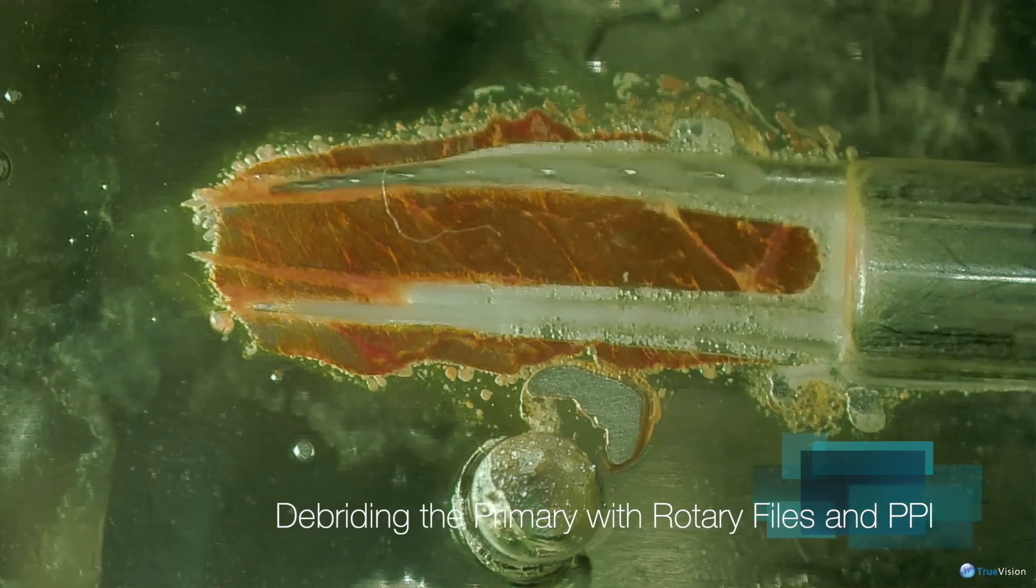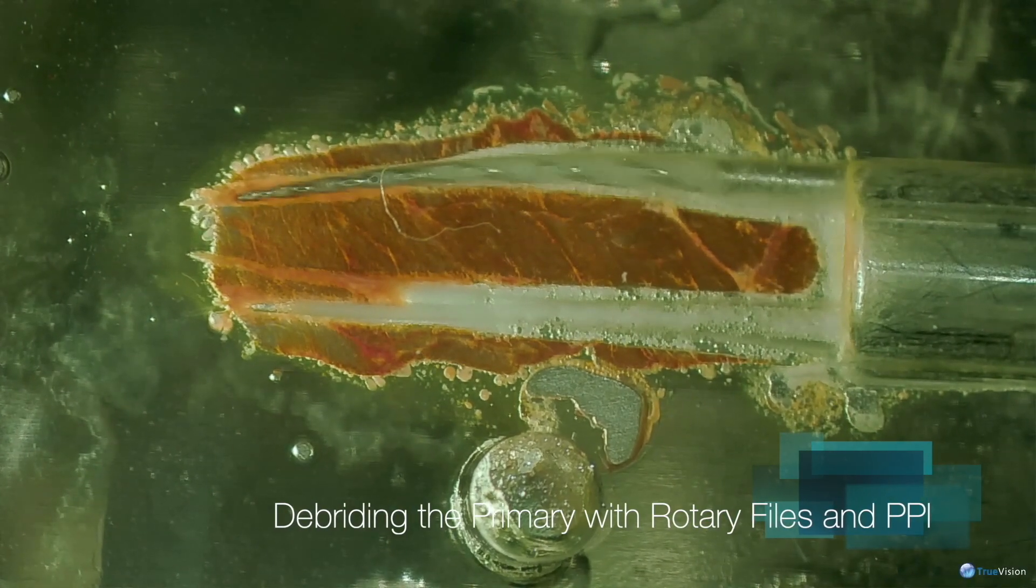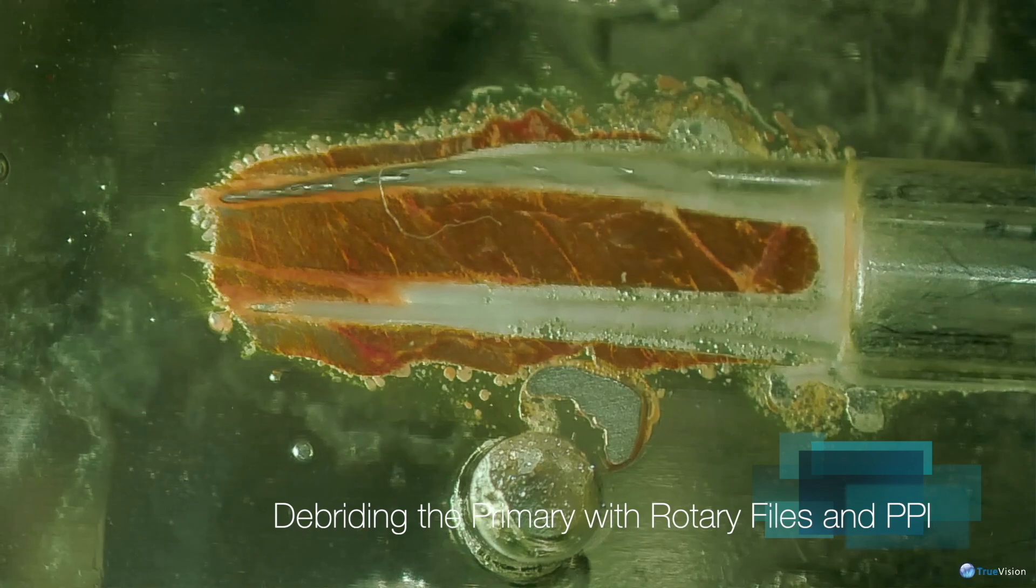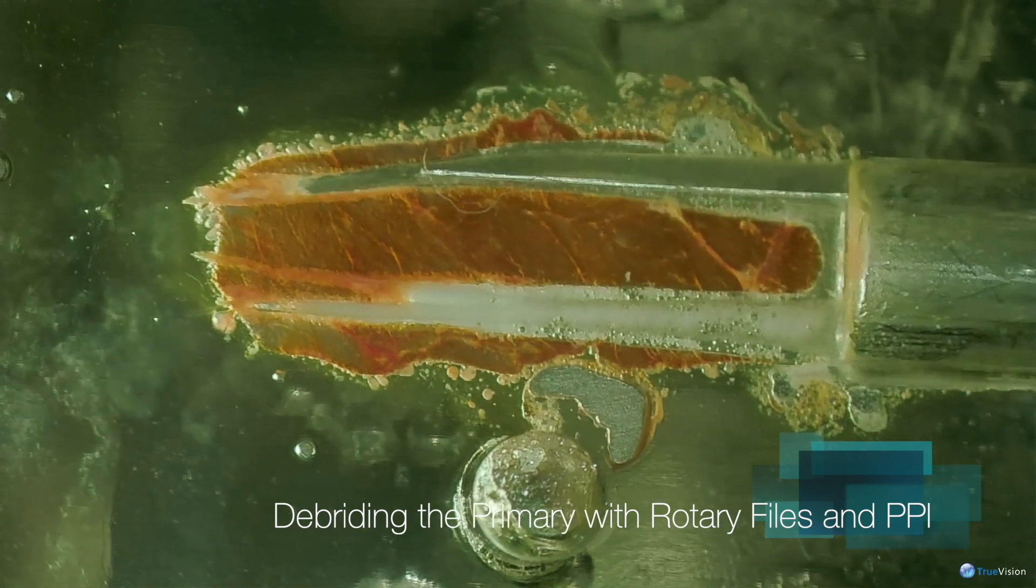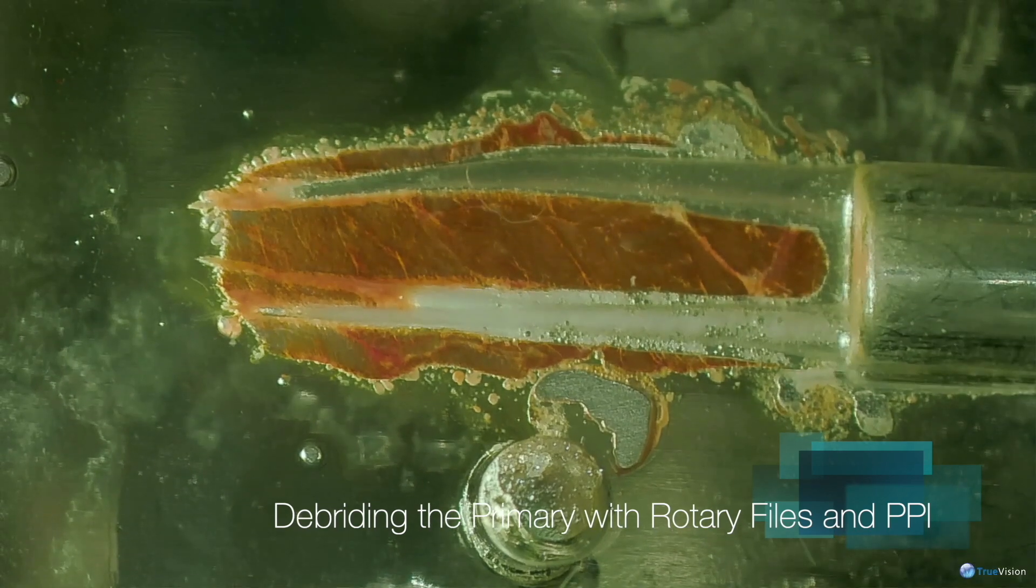Rotary files are brought in again, making a better pathway for the positive pressure irrigation needle. Here we are in the adjacent canal.